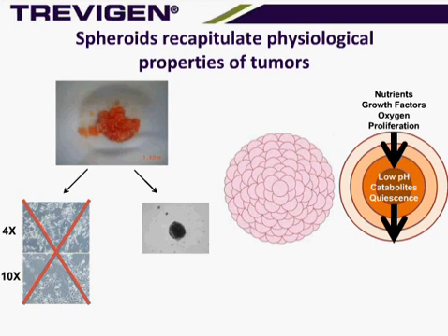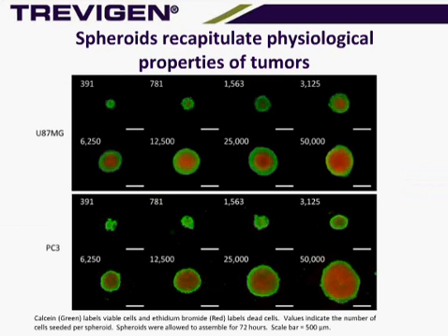Whereas the cells in the intermediate zones don't have sufficient nutrients for cell division, but they do have sufficient nutrients for viability. They become quiescent, and the cells on the outer surface, having full access to these nutrients and everything else, become proliferative. And this here very well illustrates this process and how we get these heterogeneous cell populations.